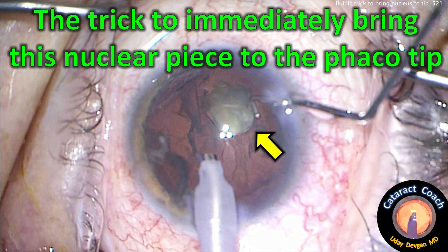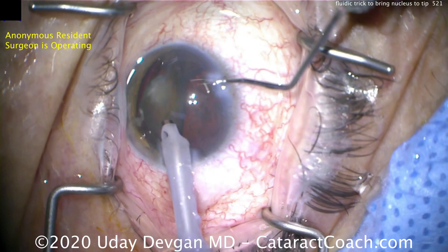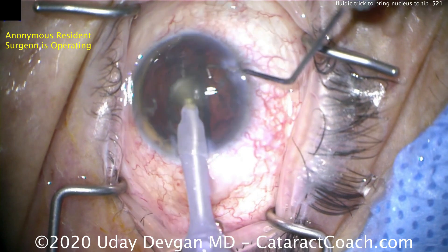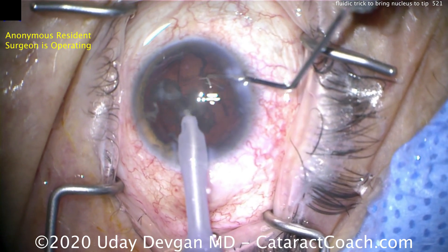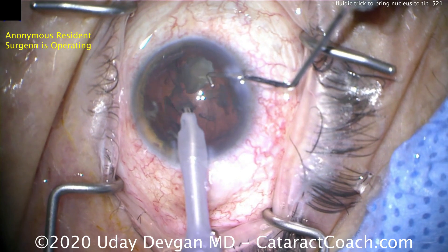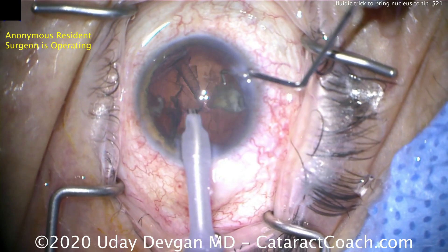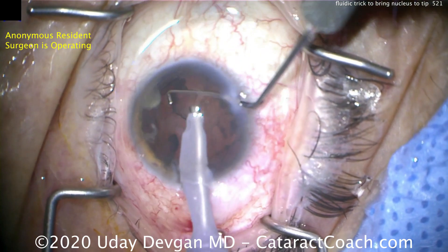From cataractcoach.com: the trick to immediately bring a nuclear piece to the phaco tip — you don't have to chase the piece, it'll come right to you. We have a junior resident who's operating and we're helping with chop. The cataract pieces are broken into smaller fragments, and there are a couple fragments that are deep in the bag. The trick to bringing them up is to twist the phaco probe.